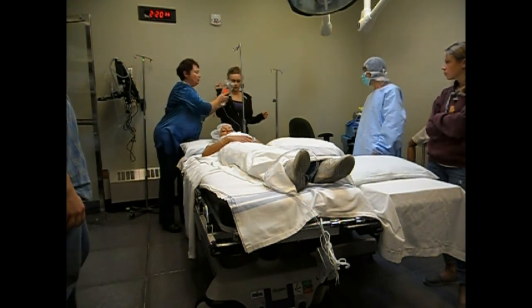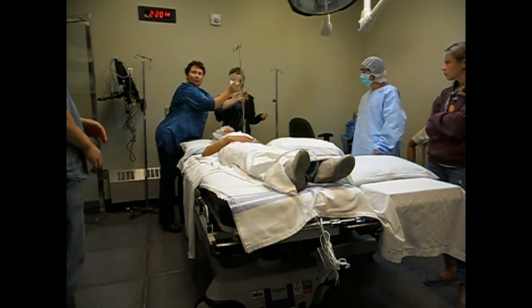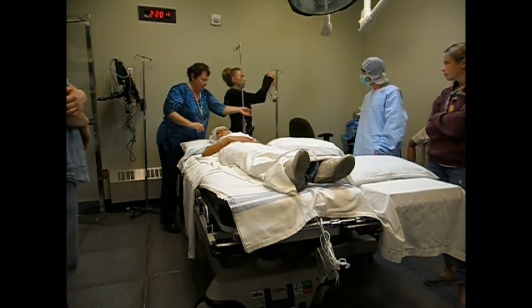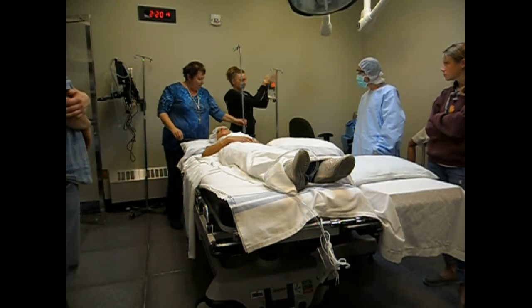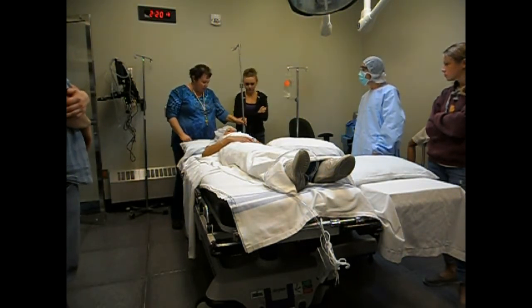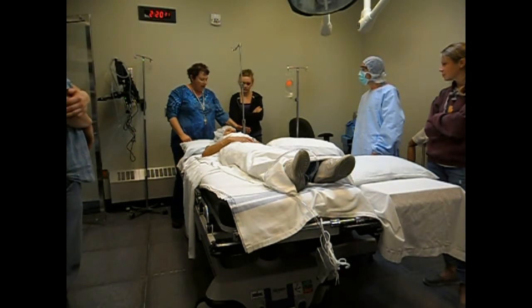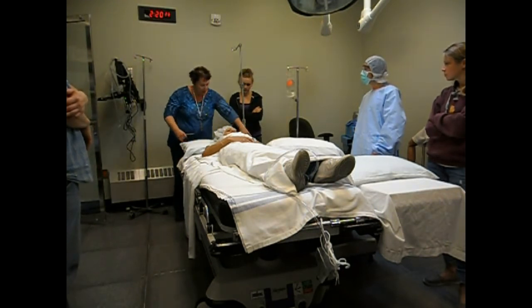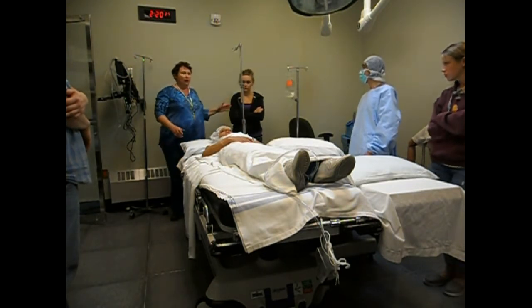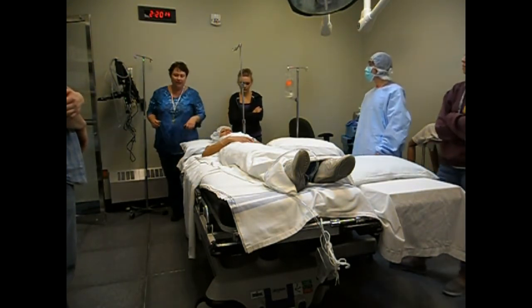Here's another thing you want to watch. You don't want to get this all wrapped around. Make sure that that is free. Now, this is stuck on this stretcher, so unfortunately we're not going to be able to lower that, but we would want to lower this IV pole so our anesthetist has clear sailing over there.